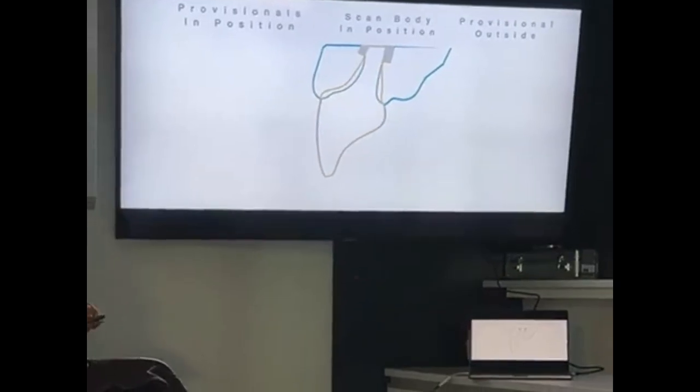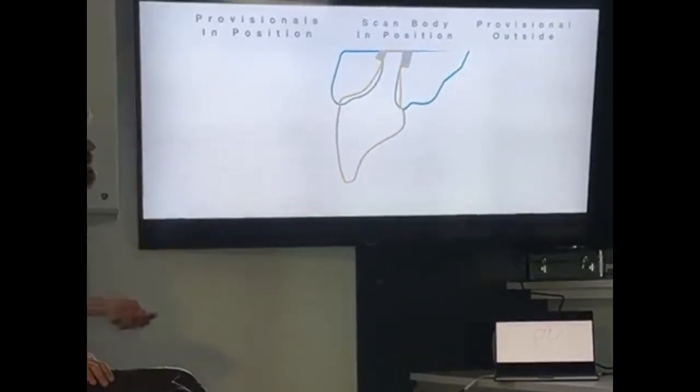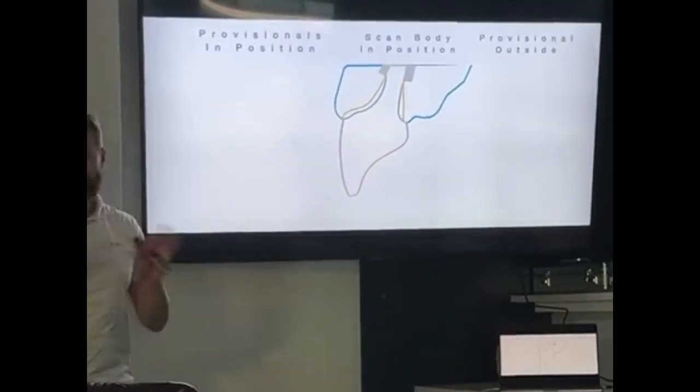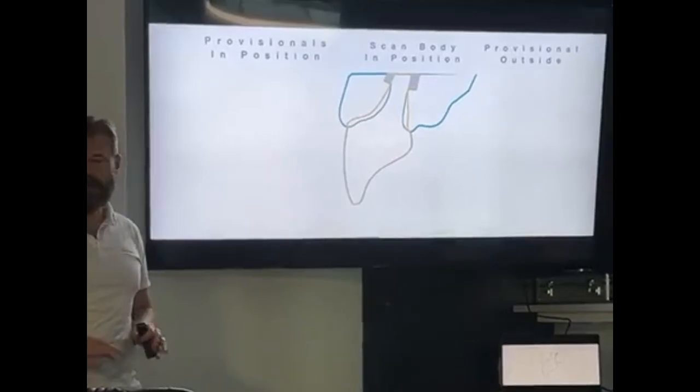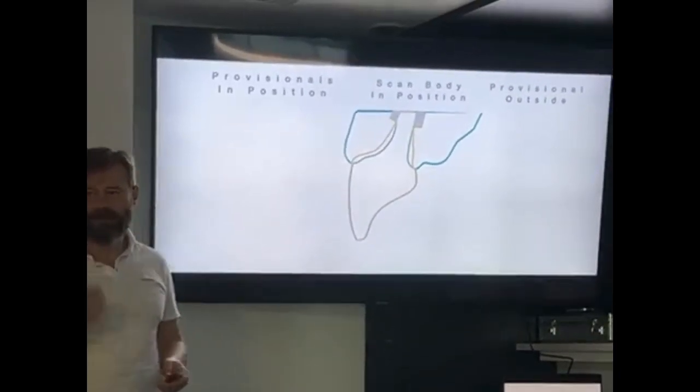Which software do you use to merge these two files? Depends on the technician, because I do not do this. I do not merge the images. I send the scan to the technician, and they're going to merge the images according to the software they use and whatever, right?